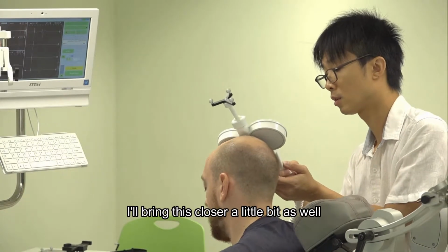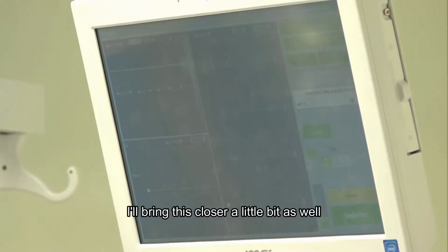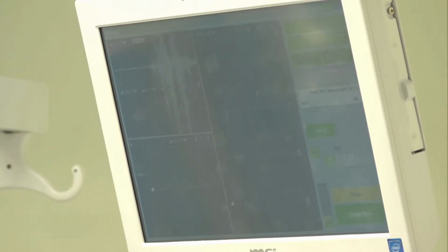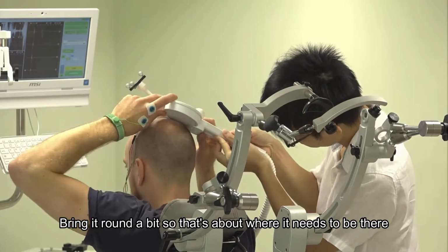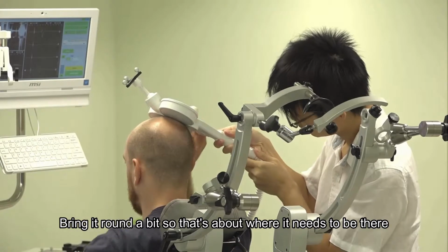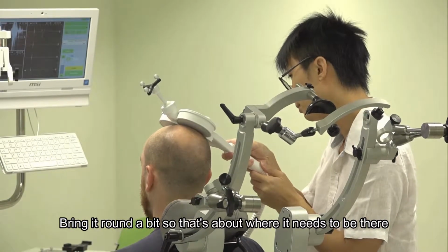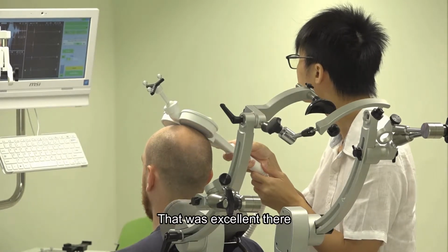So I'll bring this closer a little bit as well. It gives you a bit more to play with there. So that's it. Bring it round a bit. So that's about where it needs to be there. Like this? Yeah. Okay, that was excellent there.